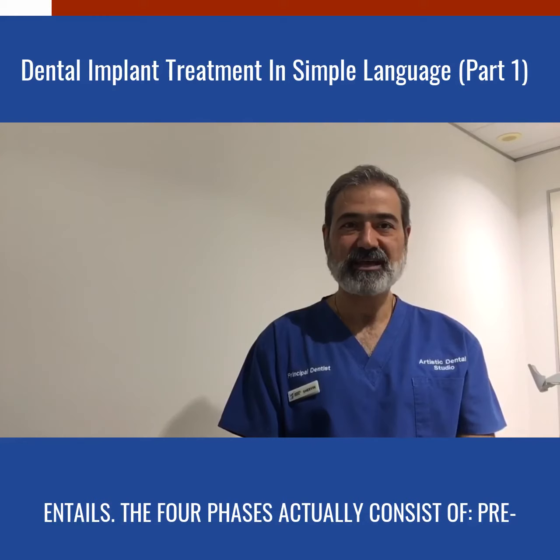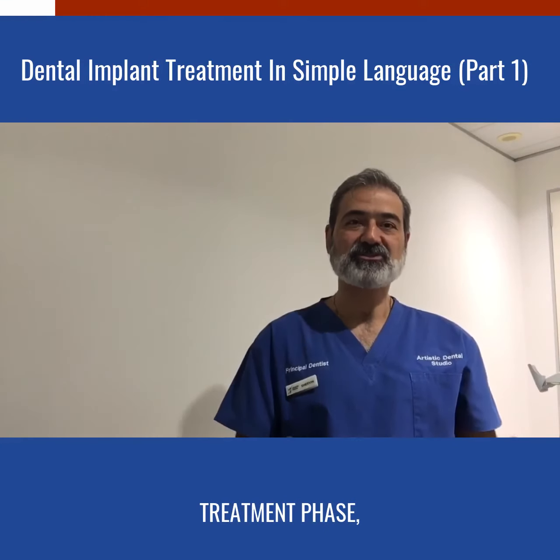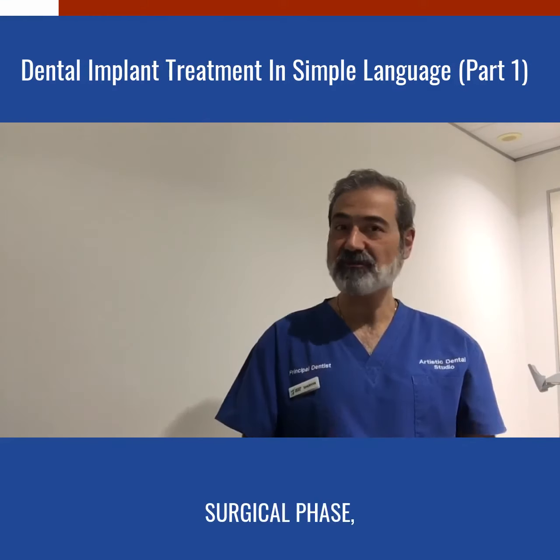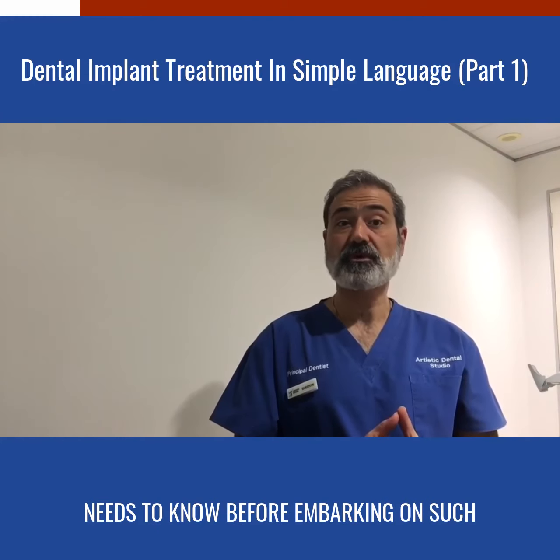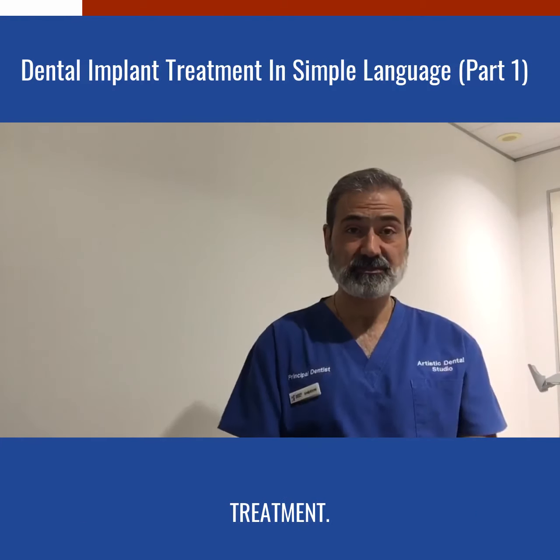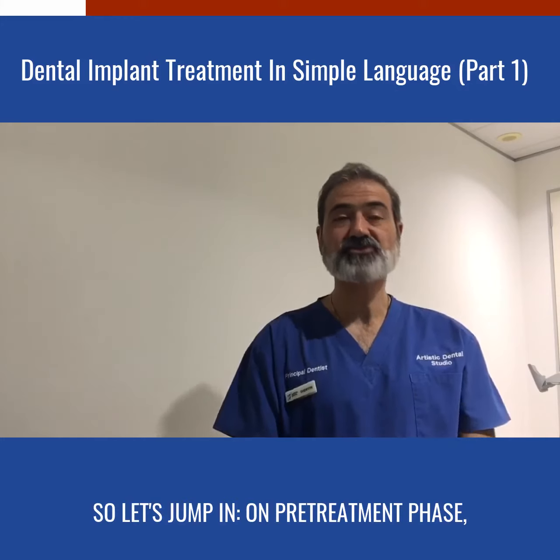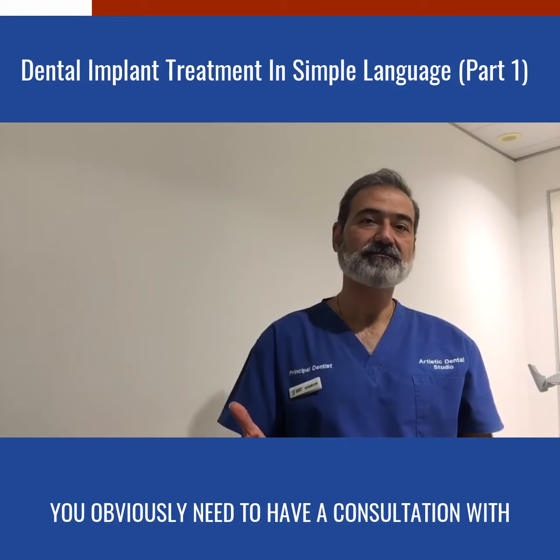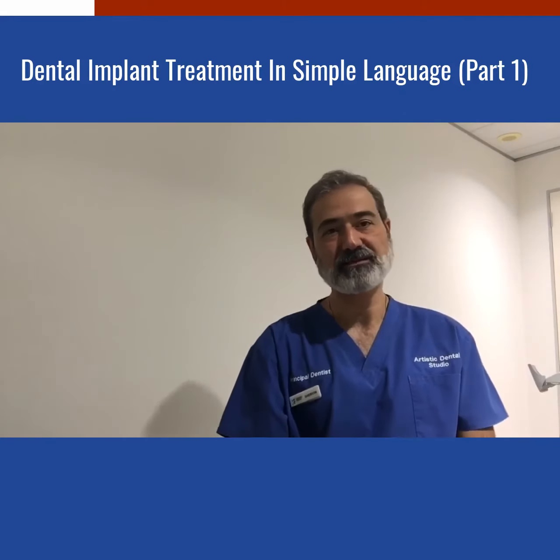The 4 phases actually consist of pre-treatment phase, surgical phase, restorative phase, and maintenance phase. I have divided it into these 4 categories so I can cover the essential points that everyone needs to know before embarking on such treatment. So let's jump in. On pre-treatment phase, you obviously need to have a consultation with your implant dentist.